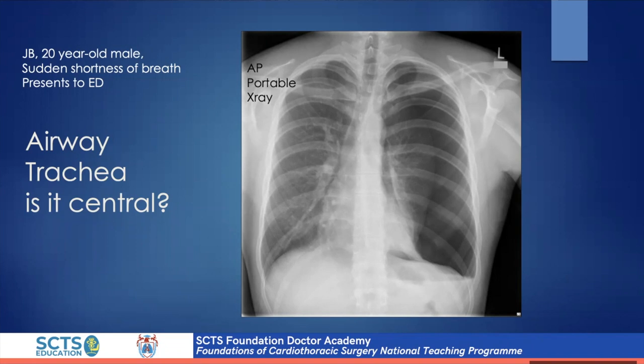So this chest x-ray is very dangerous, evidently. It shouldn't really have been taken because a tension pneumothorax is a very important clinical diagnosis to be made prior to gaining any further investigations and should be decompressed immediately. So yeah, but Mustafa, that's essentially kind of what you've said there. So well done. Thank you.